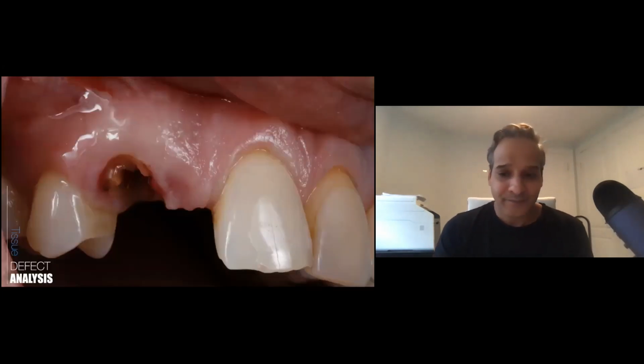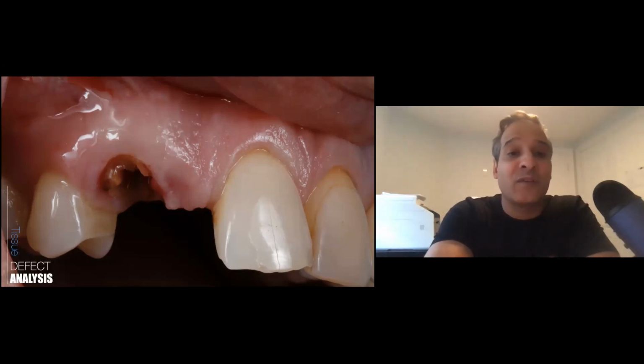So, again, soft tissues, what was a key there? Here's a case. Lady had a cantilever restoration off of the canine. And what happened was, at some point, the whole thing just fractured off. So now it's not restored, and it was referred to us to place an implant.